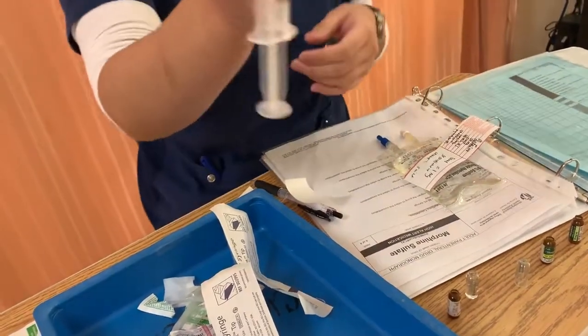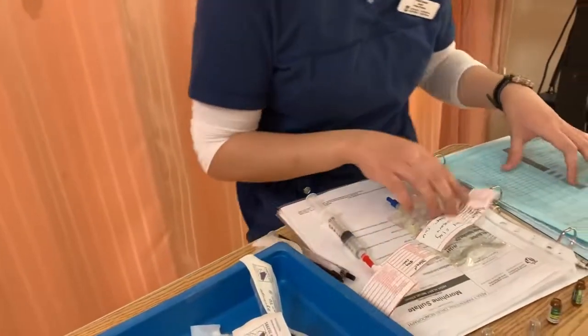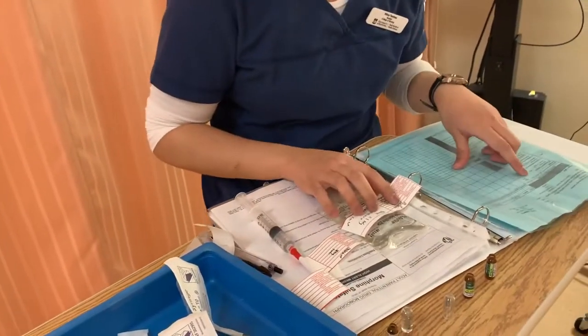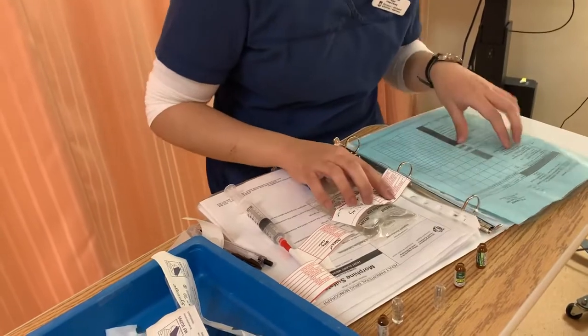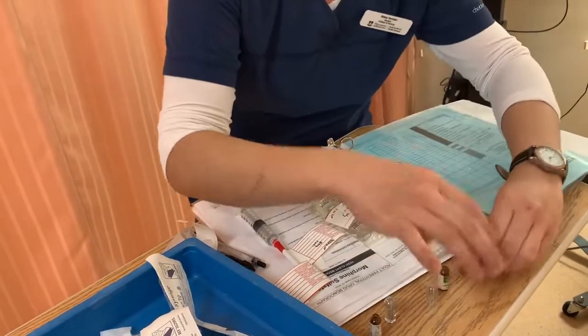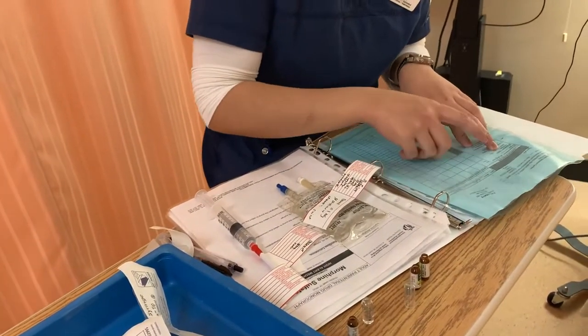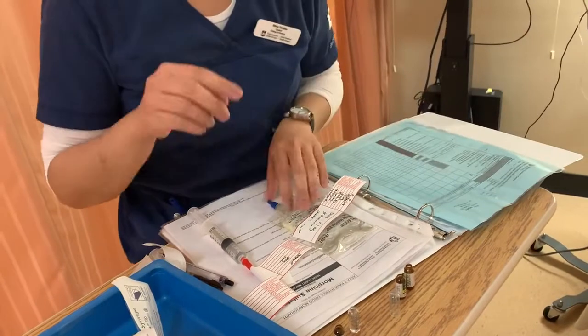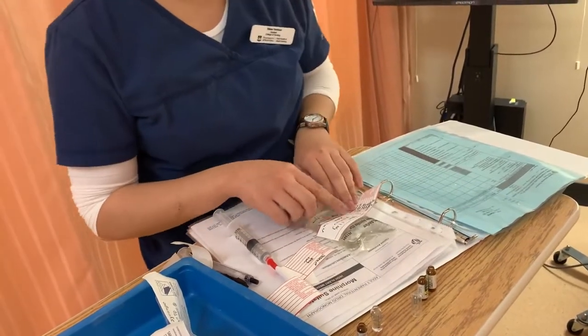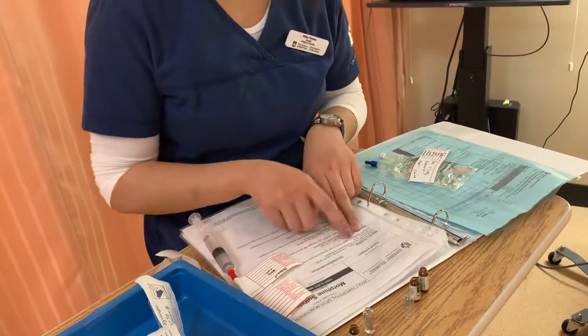There we go. So I got my label, and now I'm gonna do my second check as well as my normal saline right here. So I got my patient, Marcy Paris, and the medication is morphine. All of them are morphine. I've already checked. So morphine, and there is 1 milligram per ml as the final concentration. According to our PDM as well, that is the recipe that we followed.